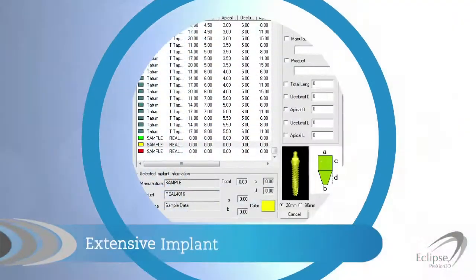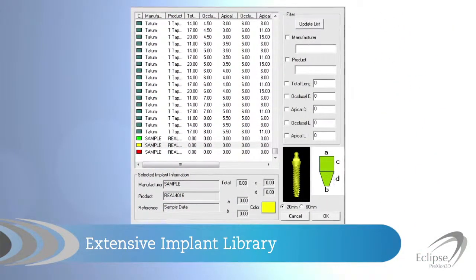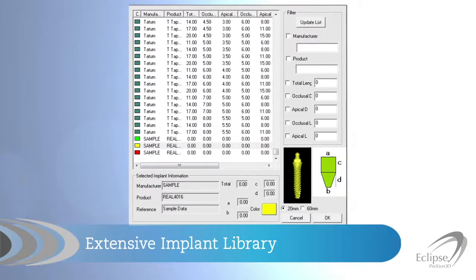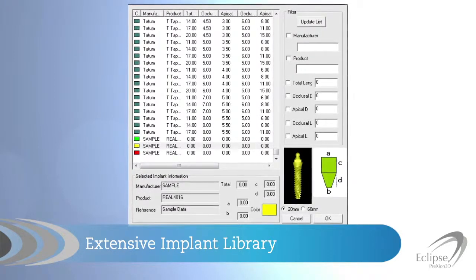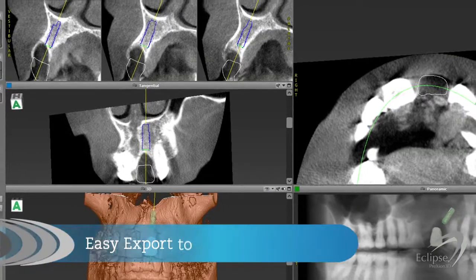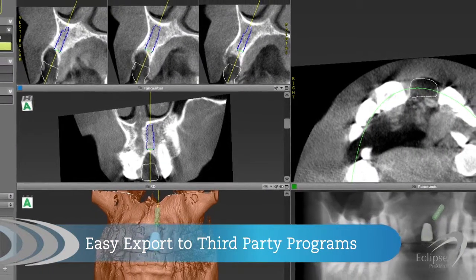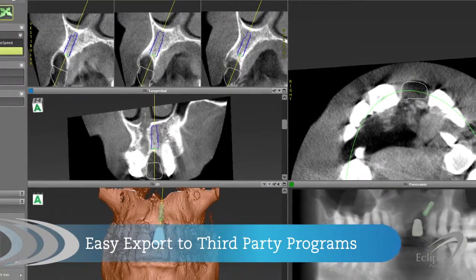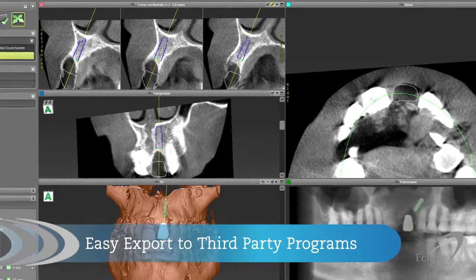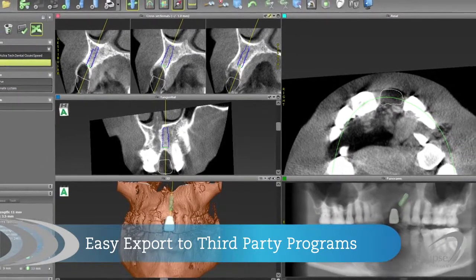As a client, you will have free access to Prexion's extensive implant library, or you can choose to customize your own. The Prexion 3D Viewer software also reconstructs to DICOM 3.0 format, allowing for easy export into many third-party surgical guide planning software programs.